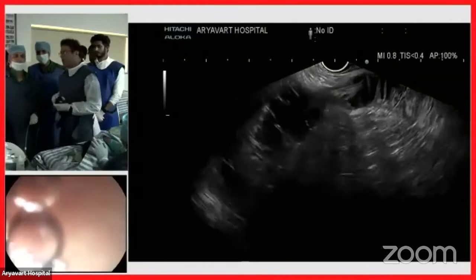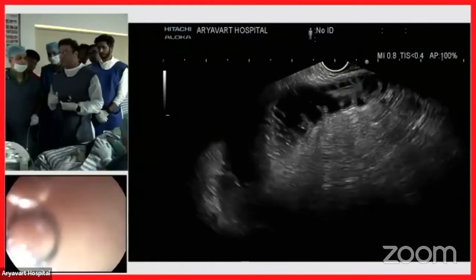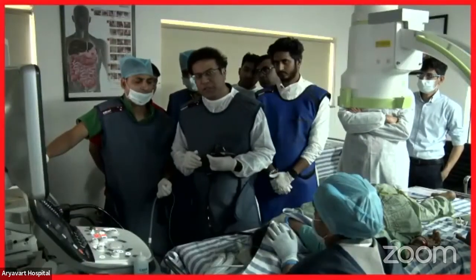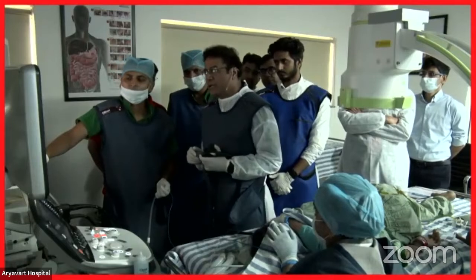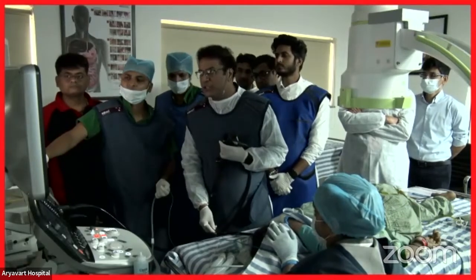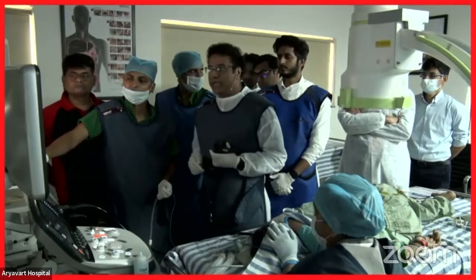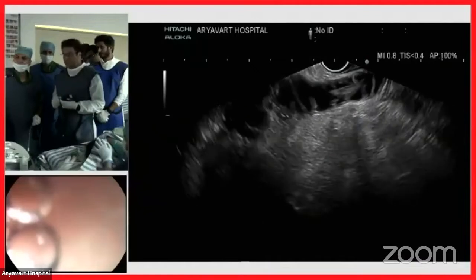Okay, so again, this is a 50-year-old female, and as you mentioned in the history, the patient is having an ampullary mass with biliary obstruction, with outlet obstruction. Initially underwent an ERCP with a plastic stent, following which she developed stent block and outlet obstruction, underwent PTBD, and now the procedure is primarily for palliation of outlet obstruction.